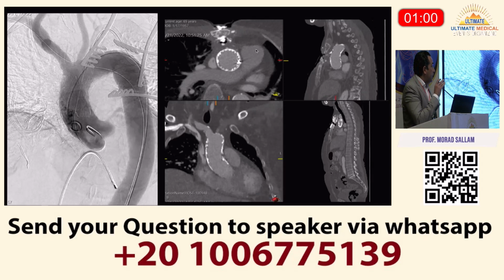It is fair to say that she was turned down for open repair because of porcelain aorta, massive infection. She's not treated because she still has infection. I just debrided her and put a VAC on two weeks ago. And let's hope we can get through, but at least she's sealed completely and she doesn't bleed anymore from the sternum.